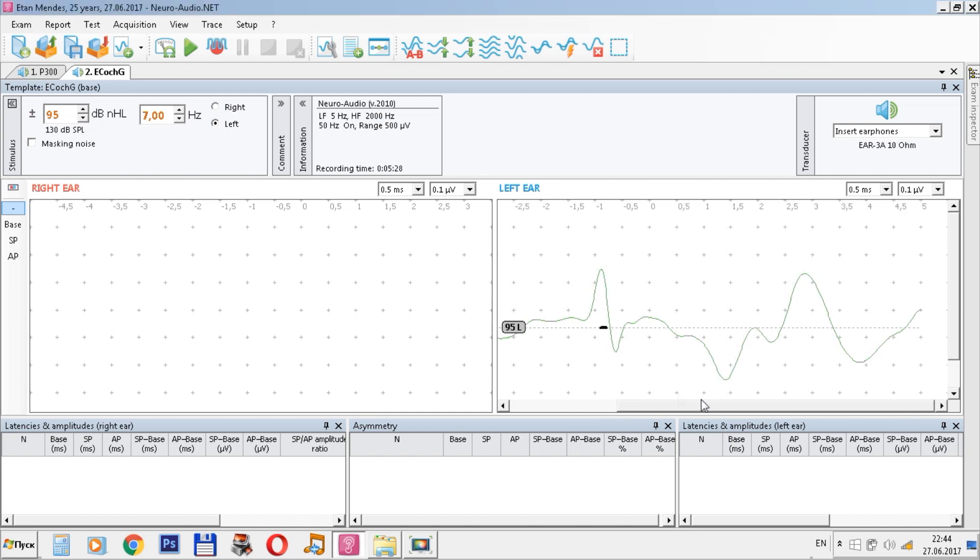We can put the markers: the baseline marker, SP for cochlear response, and AP for auditory nerve response. The program will automatically calculate all the necessary values, for example, the amplitude ratio and the area ratio, which is important in diagnosing diseases such as Meniere disease.